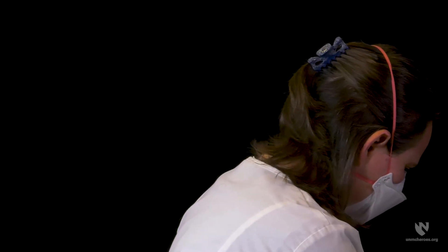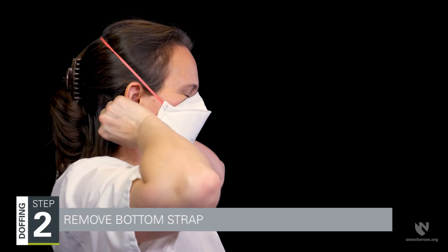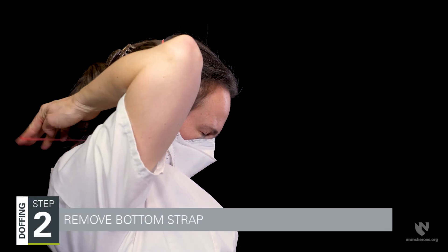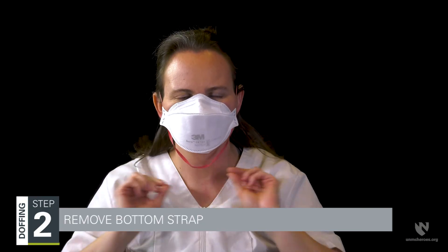If you are wearing glasses, these should be removed before your respirator. Set them aside for later cleaning and disinfection. Step two is removing the bottom strap of the respirator — touch only the strap and bring it carefully over your head.